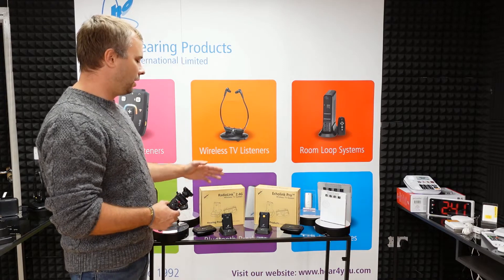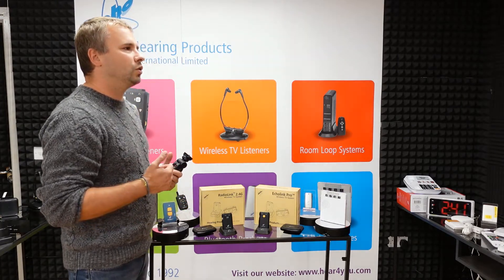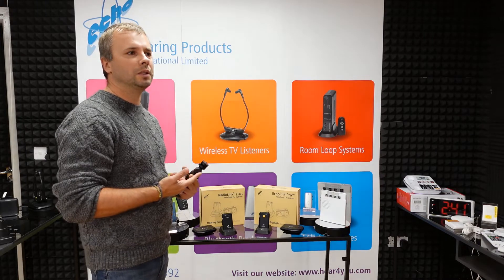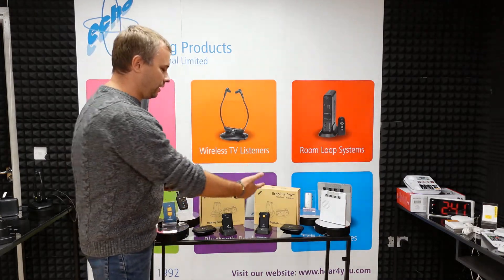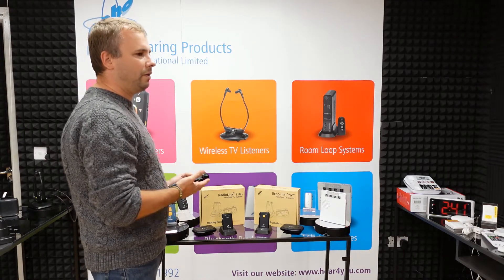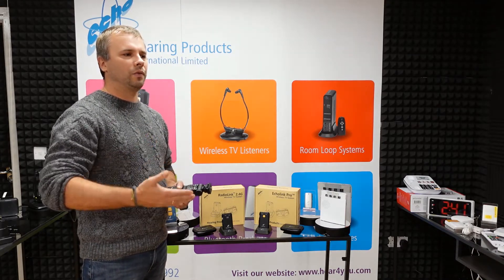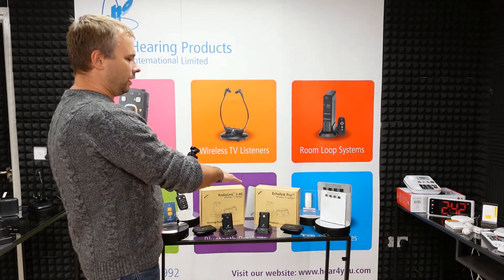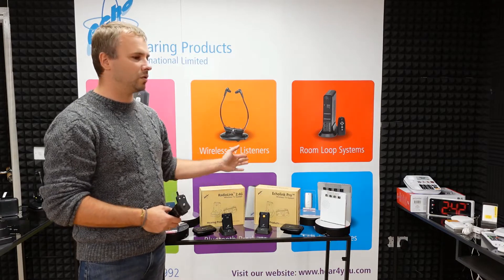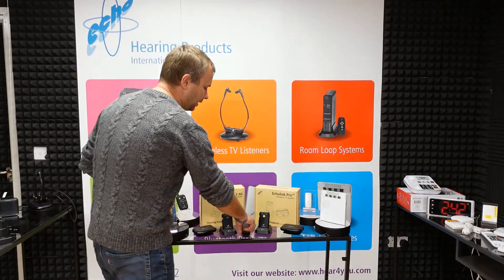As I said, both units have a microphone built into the receivers, so you can use them as TV listeners but also take the receivers out and about. If you go to the post office, a restaurant, or a shop, you can take it with you and use it as a personal amplifier. This feature is very unique because other products on the market mainly cut out when you go out of range of the transmitter. With our products, that won't happen — you can move away from the transmitter or switch it off and still use the built-in microphones.